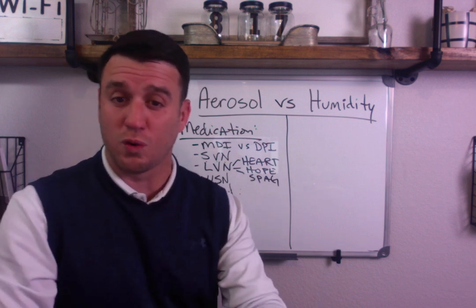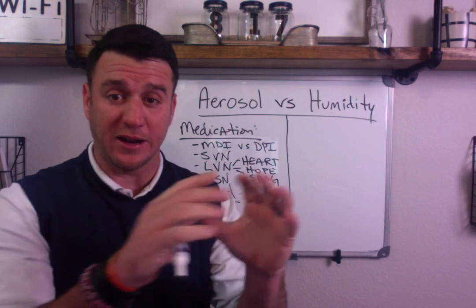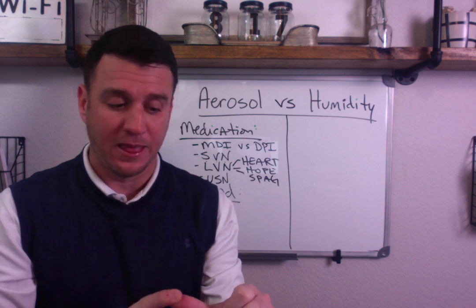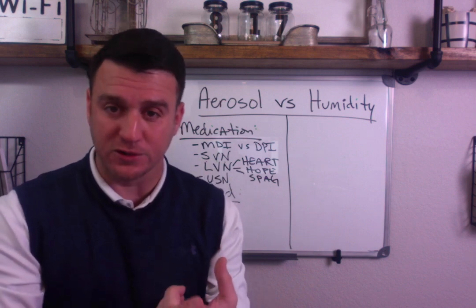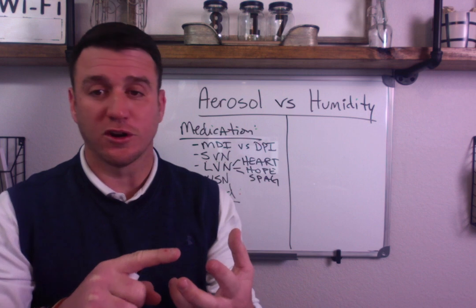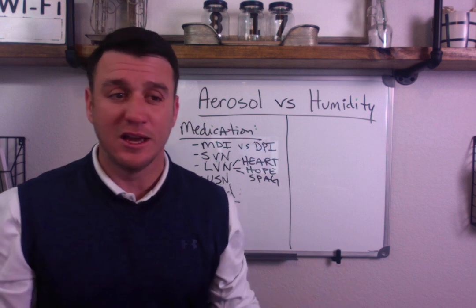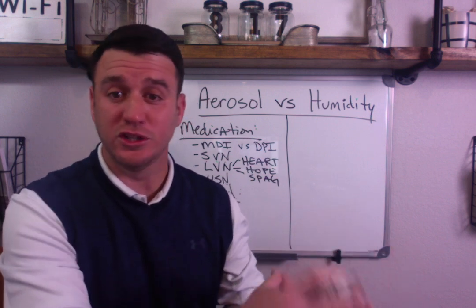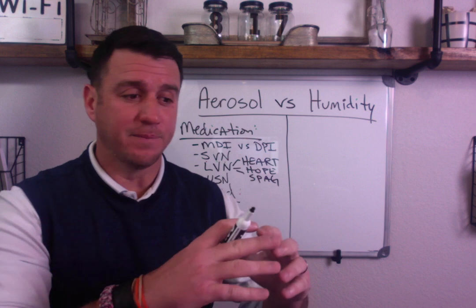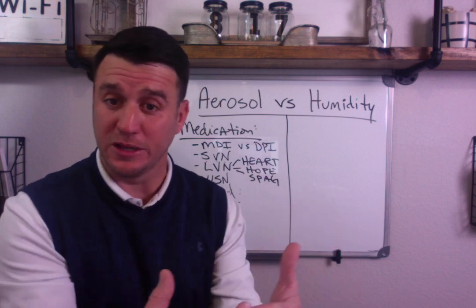You see, ultrasonic nebulizers work off of amplitude and frequency. Output, total output, when we're talking about aerosol output from the device, is directly proportional to the amplitude. Particle size is inversely proportional to the frequency. So if you want larger particles, you turn down the frequency. If you want smaller particles, you turn up the frequency. Now, most of these devices on the user end don't have the ability to adjust frequency. So this would just be a question-based scenario, okay? They do give you the ability to manually adjust the amplitude, which will adjust, as we've already mentioned, the output of the aerosol, okay?